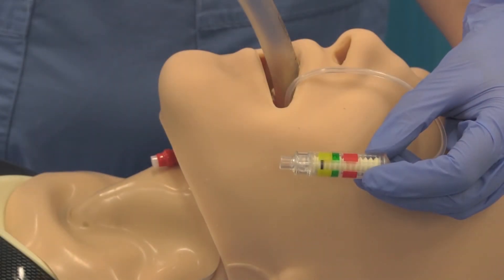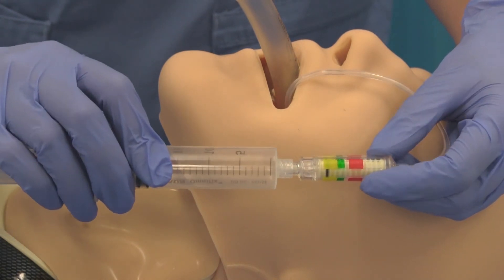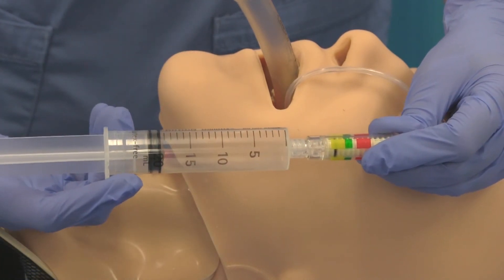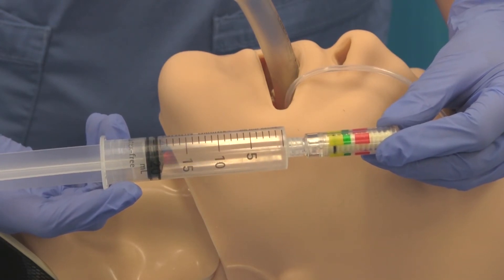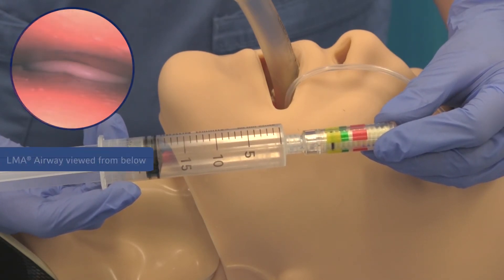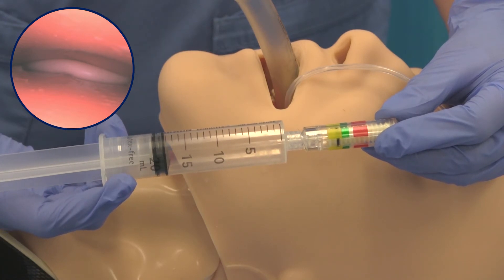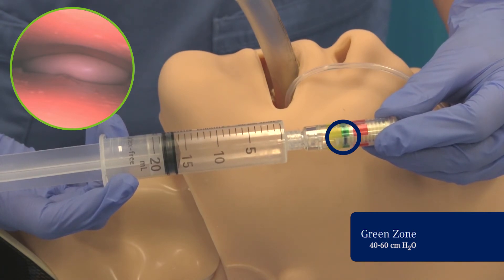To inflate the LMA airway with Cuff Pilot Technology, push and turn the syringe to firmly connect the syringe to the inflation port. Ensure that the tip of the syringe is inserted far enough that it makes contact with the silicone valve within the cuff pilot valve. The cuff should be inflated with sufficient air to prevent a leak with positive pressure ventilation, but must not exceed either a pressure of 60 centimeters of water or the maximum cuff volume of the specific device. The green zone designates optimal pressure of 40 to 60 centimeters of water; introduce air until the black line is within the zone and a seal has been obtained.